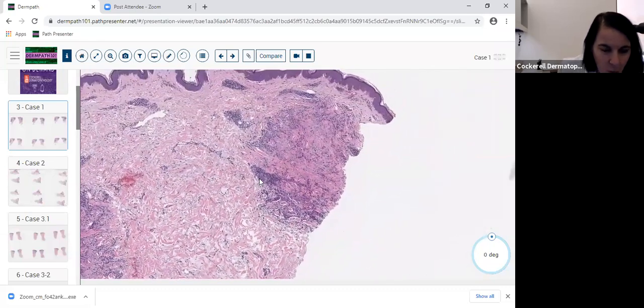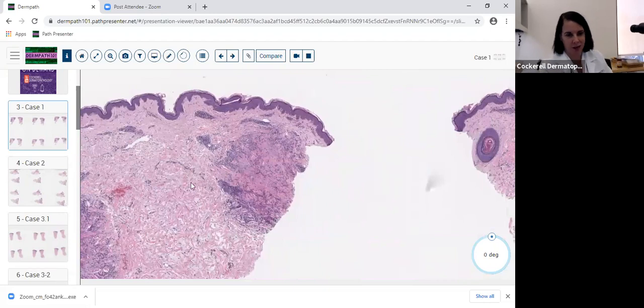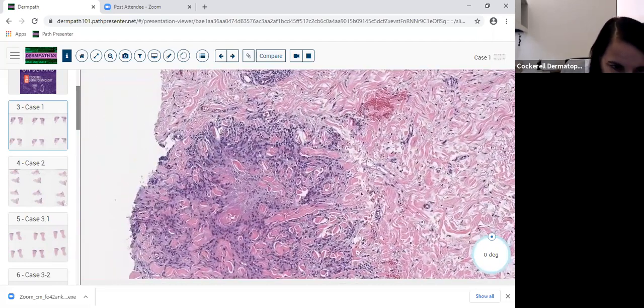So why isn't it a DF? Well, it's not a DF because of the central areas. It's also not a DF because you have these multifocal areas. So let's just say you got stumped and you looked at these histiocytes and you said, well, I think this is a DF. I don't think it's GA. It's just a DF. Well, it's not.